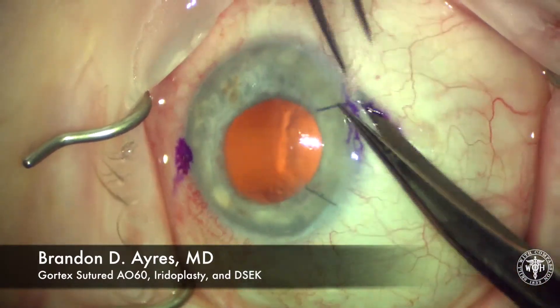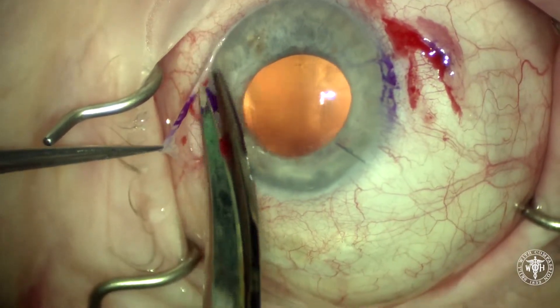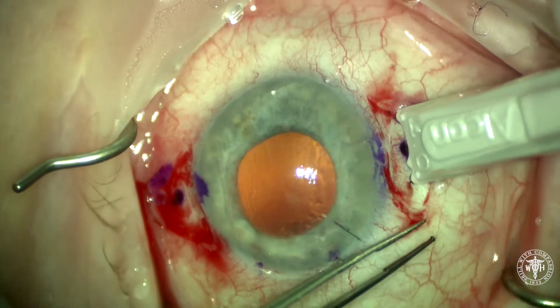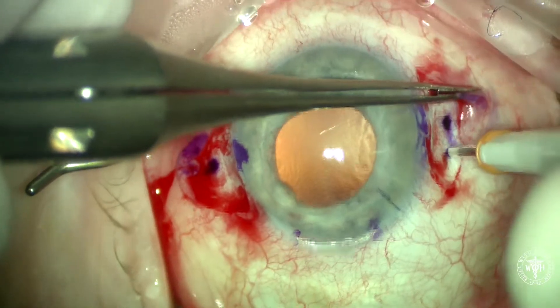This is going to be a Gore-Tex sutured IOL combined with a small iridoplasty and a DSAEK. What you can see us doing is creating small peritomies at 6 and 12 o'clock, measuring 2mm posterior to the limbus and then 4mm apart.